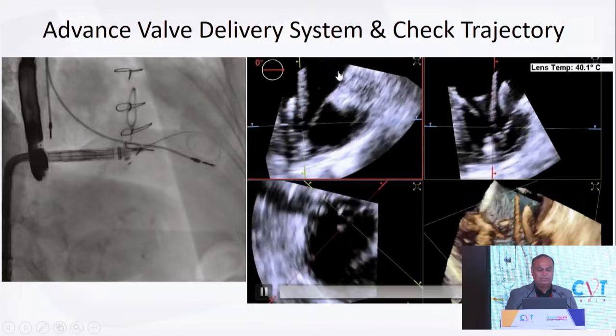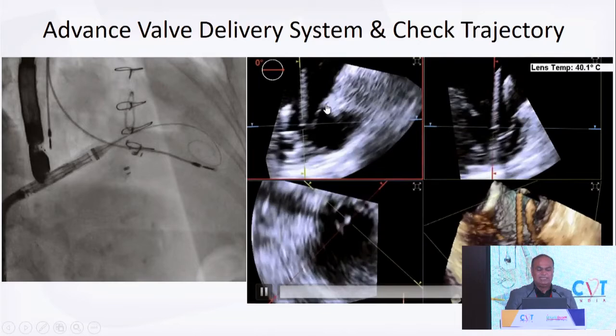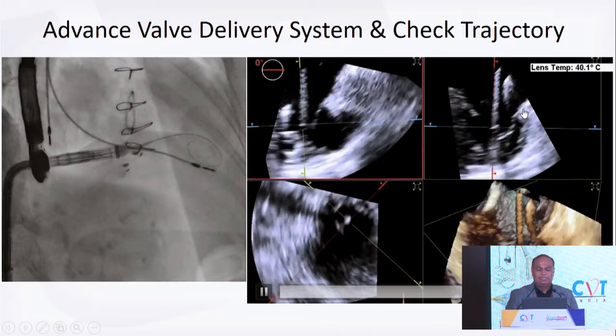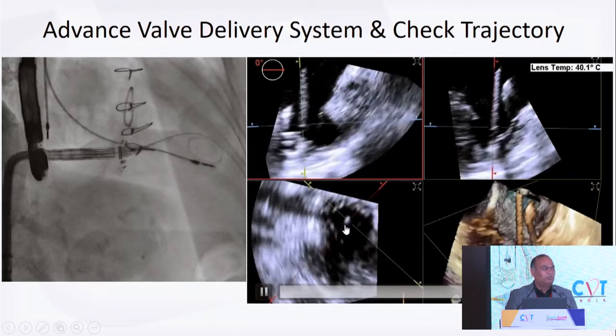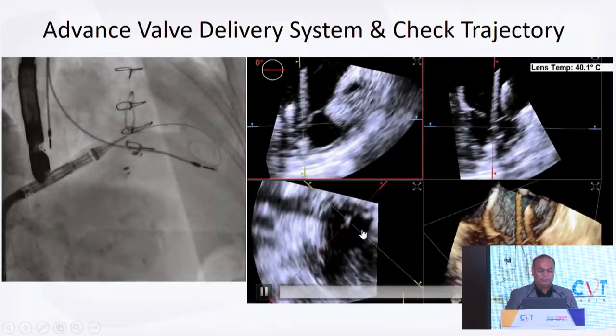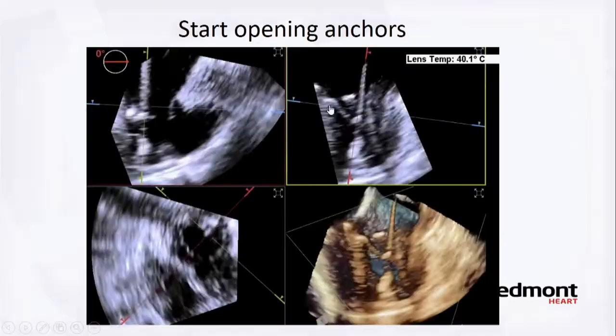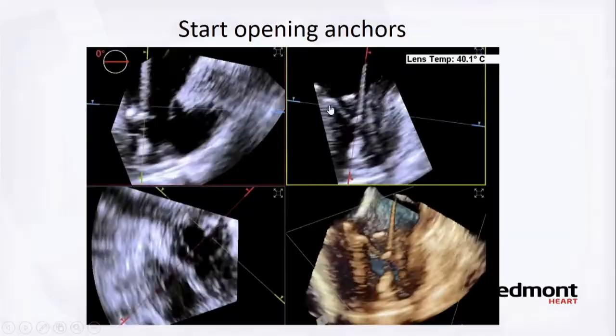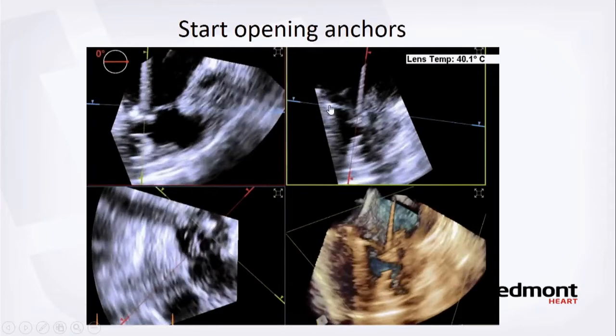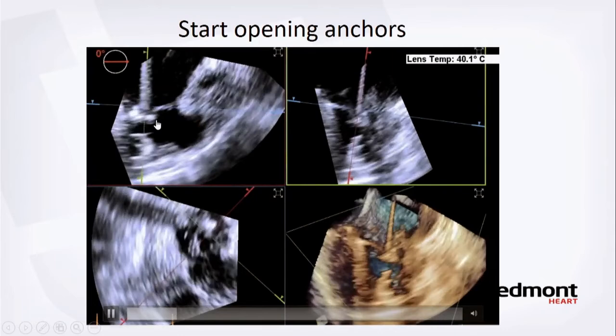Align the catheter: posterior is where the pacemaker lead is, anterior on the other side; on the other view, septal on one side and lateral on the other. In short axis, the catheter should be right in the middle with the pacemaker lead at the post-septal commissure. Once trajectory looks parallel, start opening the anchors — the bright spots on imaging. Before opening, ensure you have enough height above the papillary muscle level.